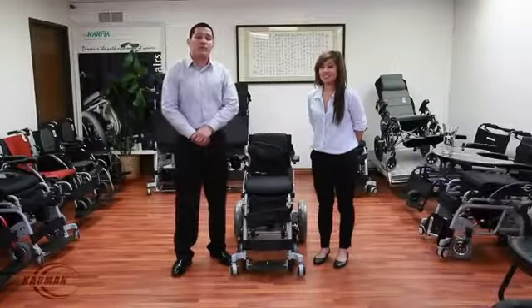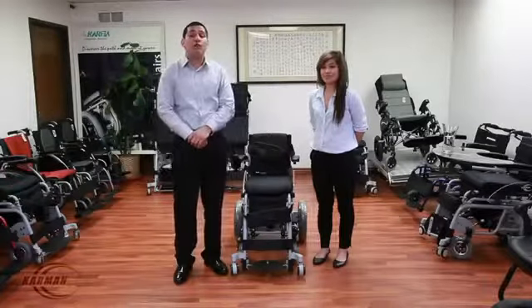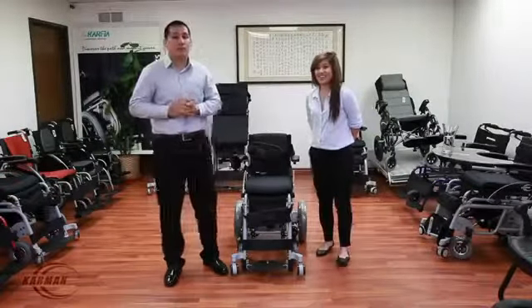Hello everyone, Edward here with Karman Healthcare. Today's product video will be about our XO202 Stand Up Power Wheelchair.